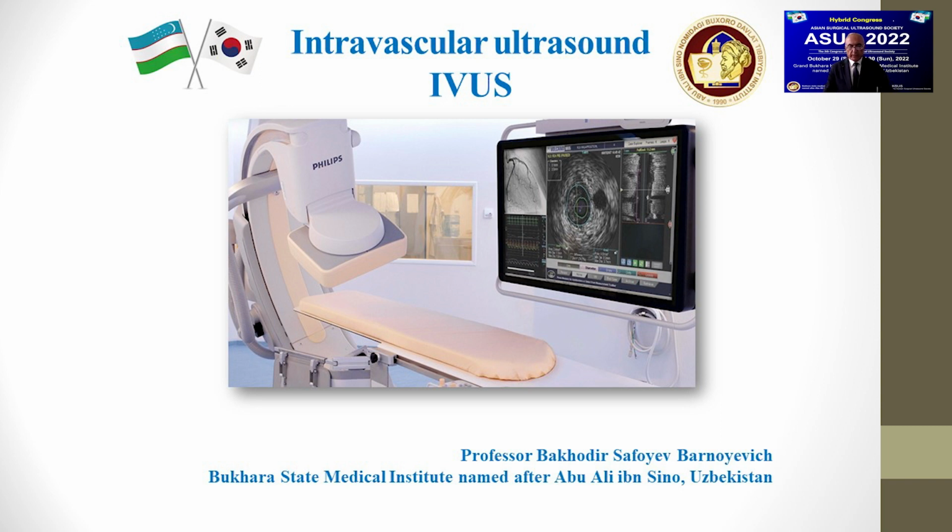My report is devoted to the use of intravascular ultrasound examination in the pathologies of the pulmonary and coronary arterial vessels. Until recently, in the study of the pulmonary and coronary vessels, we used the method of Dopplerography and angiography. During the last few years, additionally, we have begun to use intravascular investigation that allowed us to significantly facilitate the diagnosis and treatment of patients with vascular pathologies.